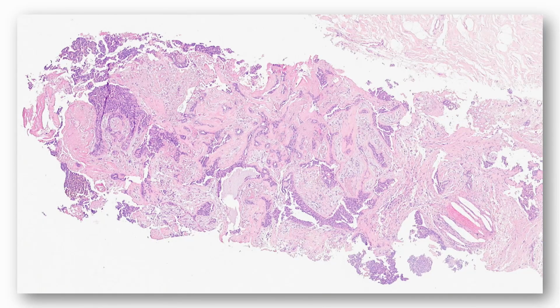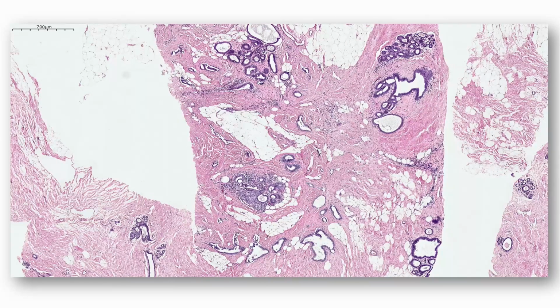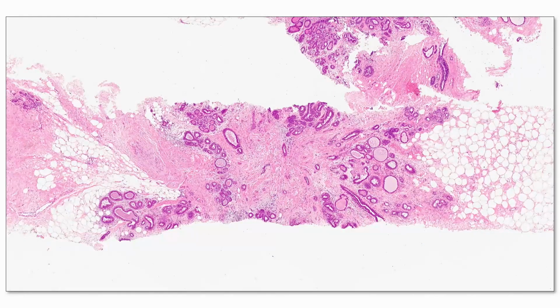If there's ever pink stroma, fibrotic stroma, or elastotic stroma, think about benign lesions first, rule them out before leaping to invasion. And in fact, I think you can even see the myoepithelial cell layer here. And this looks like a very heterogeneous epithelial cell population. Contrast that with this, where you do have a very few small glands, in a more haphazard arrangement and not really this central nidus as such. So this is a small tubular carcinoma.